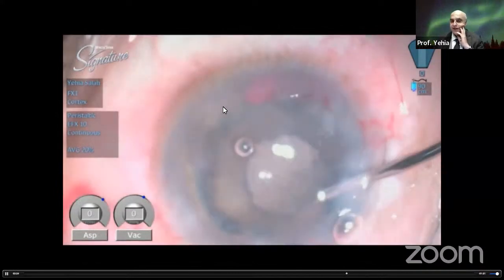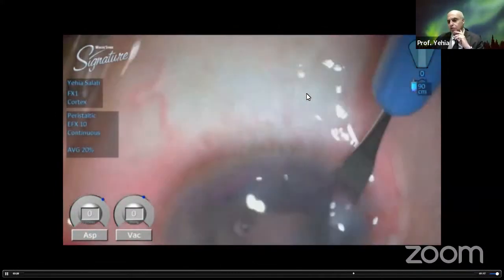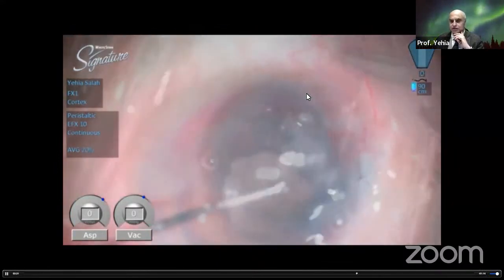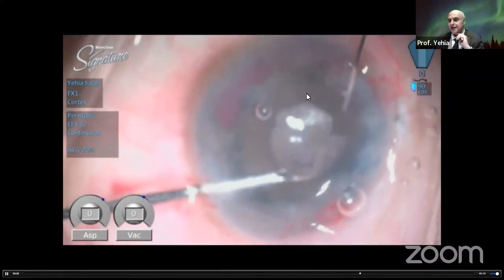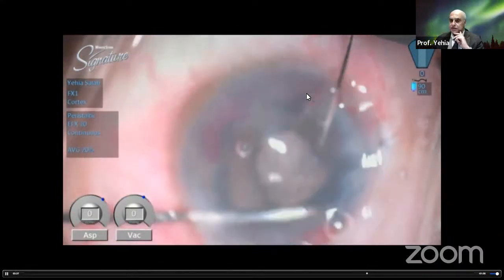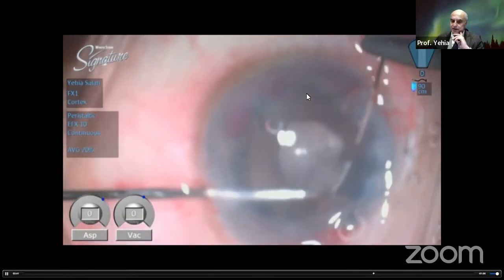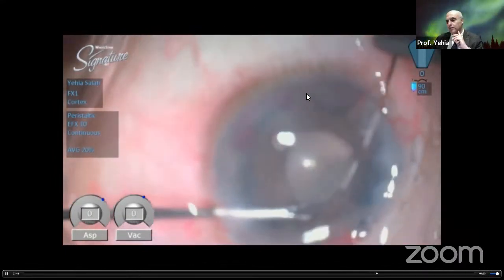And you can see the bleeding coming from the area of the synechia. I will just do one suture just to stretch the iris in this area to avoid recurrence of the peripheral anterior synechia. So using the straight needle here, of 10-0 Prolene, you pass it from one point to the other.